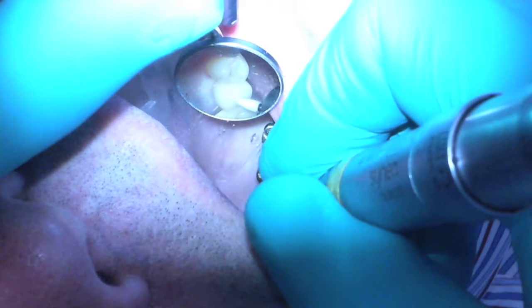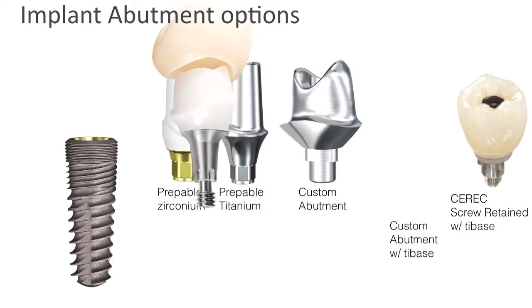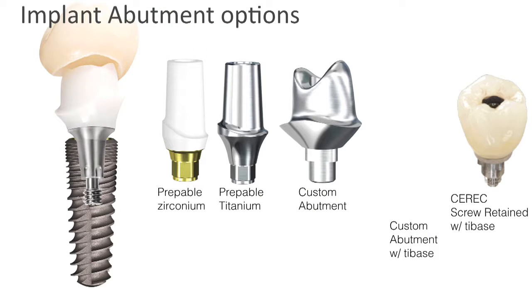That's my custom abutment with Ti base. So the option I have is to turn that into a custom abutment. I'm a big fan of CEREC because in the middle of this, if I'm planning the implant and I decide I can't do it screw retained, I can flip it and split it into two: an abutment part and a crown part. Suddenly it makes two pieces out of what was going to be screw retained. So I can make that call as I'm planning the restorative portion.